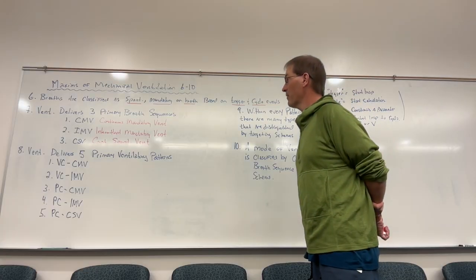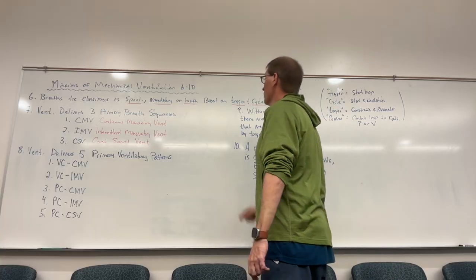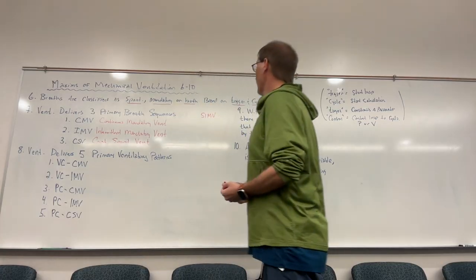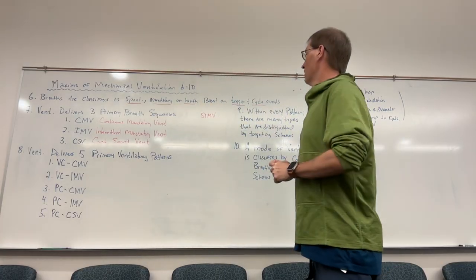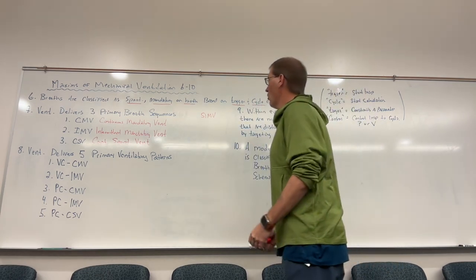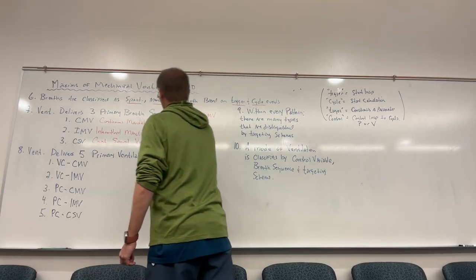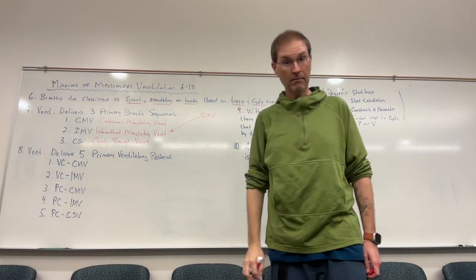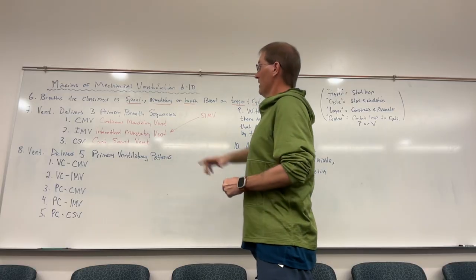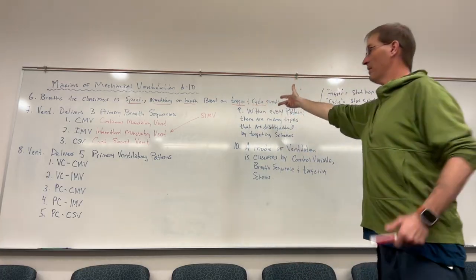All right? So those are the three primary breath sequences. All right? So if you select, say your ventilator has an SIMV mode, whatever that does at the end of the day, right? We know that SIMV stands for synchronized intermittent mandatory ventilation. We know that the breath sequence of SIMV is going to be IMV. It's literally in the name, right? So we know that much. So that's one part, all right? So one part is classifying the breaths. Are these spontaneous breaths, mandatory breaths, or a combination thereof?